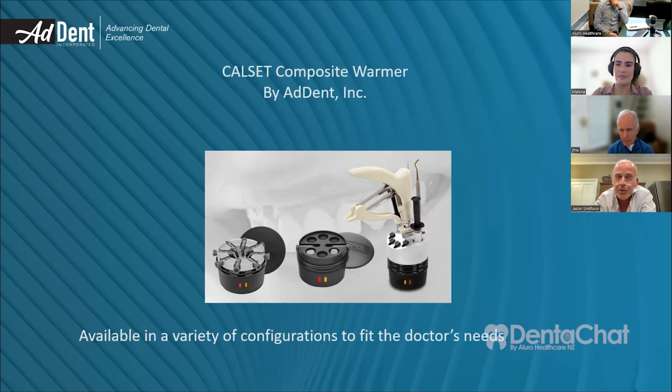Now, as Josh will probably have told you, the cooling curve of the composite is super steep. So by the time you get it to the tooth, it's barely heated. Now, the cool thing about the Calset is, firstly, you're putting the compule gun into the heater. So you're pulling that out and taking it straight to the tooth.